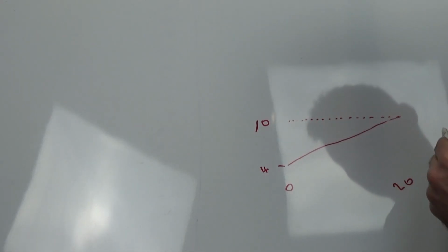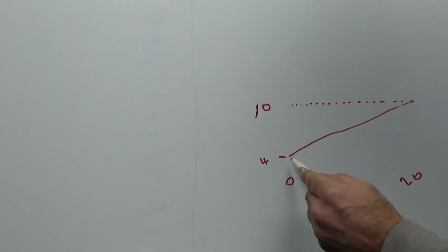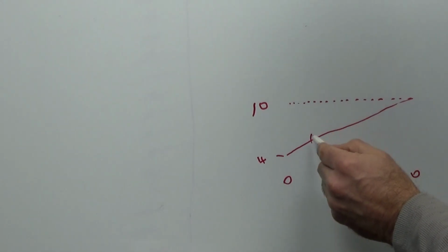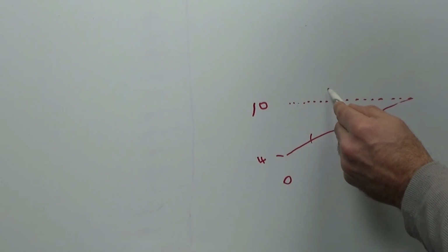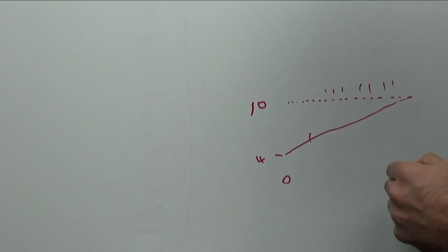It's going to start off at like 4, and over a period of 20 minutes, the pressure is going to be increasing in a linear manner, even if you're on AutoPAP. It's going to be increasing up to whatever it needs to be. So for this example, that is 10. So hopefully you can see why this is a big problem. So pretend that you fall asleep in like 5 minutes. You fall asleep right here. Now this gives you a period of time to have apnea, hypopnea, apnea, whatever. You're getting crap sleep for 20 minutes.